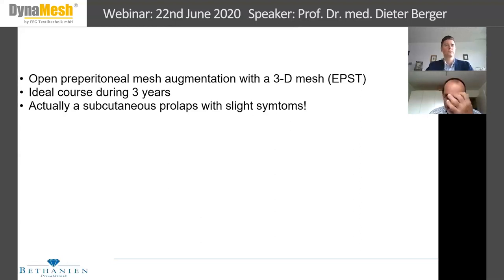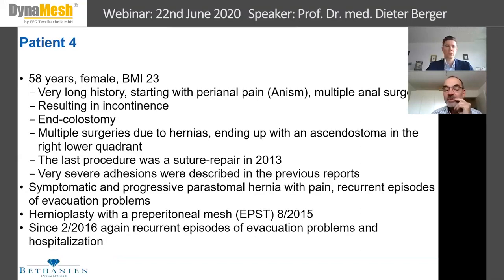The open onlay has been shown by a review of Bibi Hansson not to produce very promising results. I would not recommend an onlay. You can prepare preperitoneally, usually also in these patients with very severe intra-abdominal adhesions. Okay, that was all the comments for the time being.